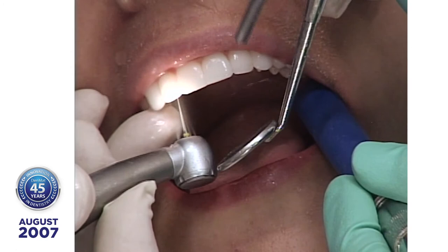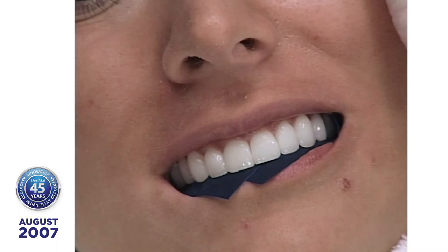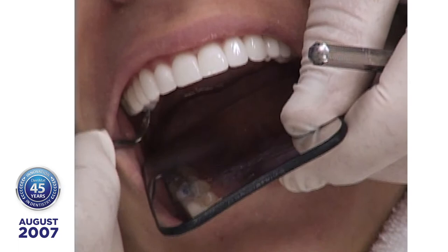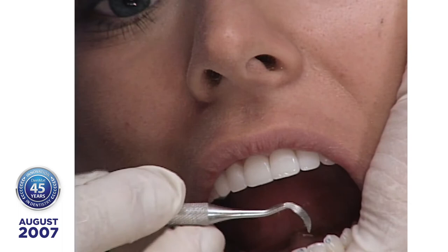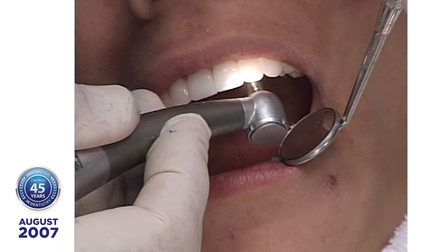Let's take a look at her occlusion now — that's very important. Grind your teeth around. We'll see what marks we have. You feel a little lump back here? That's the ultrabond on the extra tooth, so we'll get that out next. I've got marks on the lingual side — natural teeth on natural teeth. See this little mark on the mesial of that cuspid? The mandibular cuspids like to knock off the distals of the laterals when going into protrusive. So you teach that to your patients: if you want to move your teeth around, don't clench them.